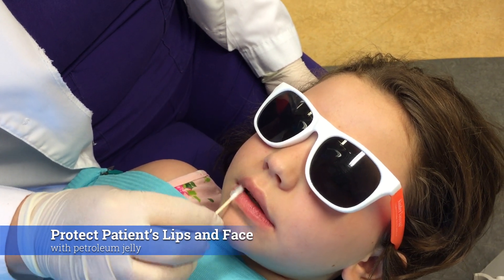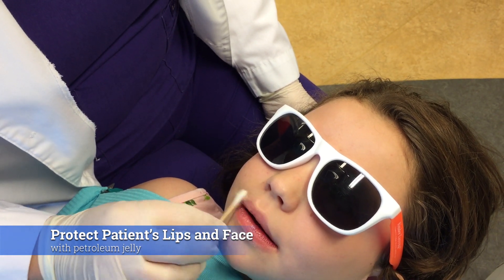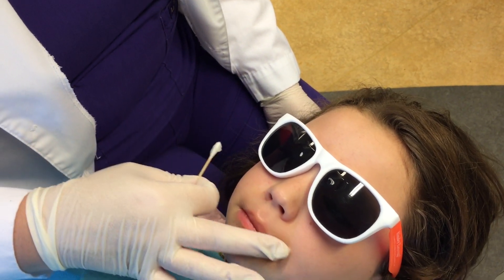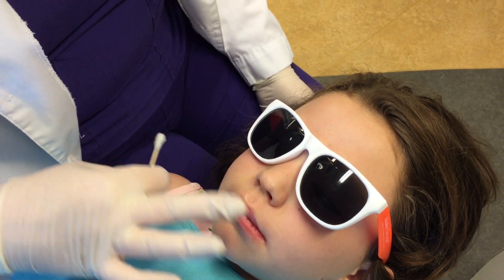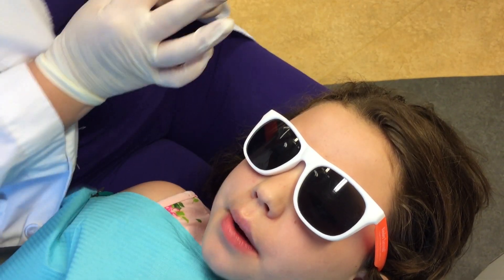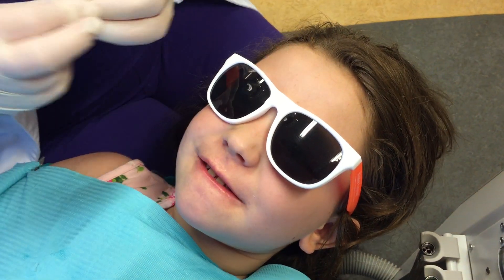First thing I like to put some Vaseline on their lips and face just so I don't get the SDF on them, because it can leave a little temporary tattoo — kind of like a henna tattoo — that will disappear within a couple of days all on its own, just depending how quickly their skin cells turn over. You can also get it off with hydrogen peroxide.